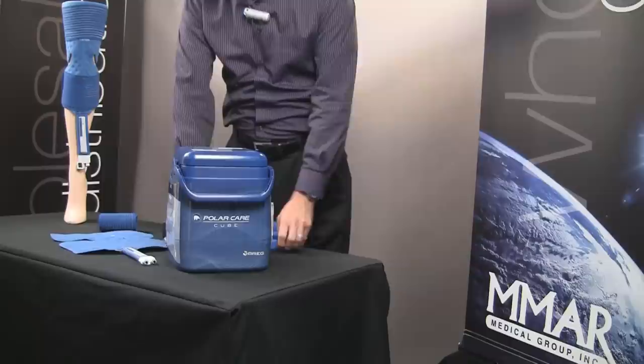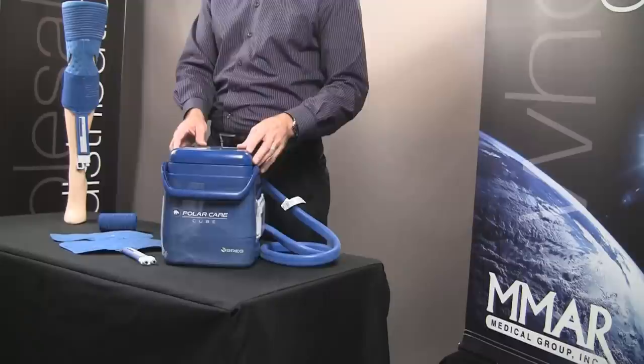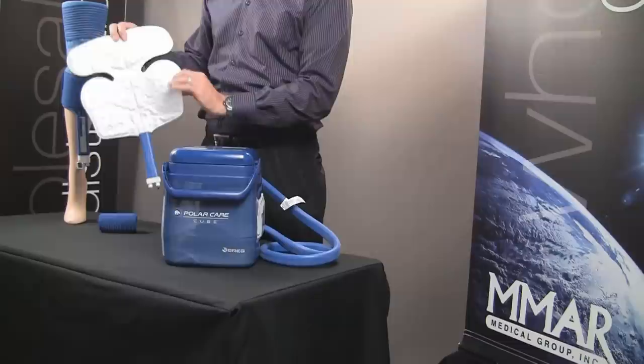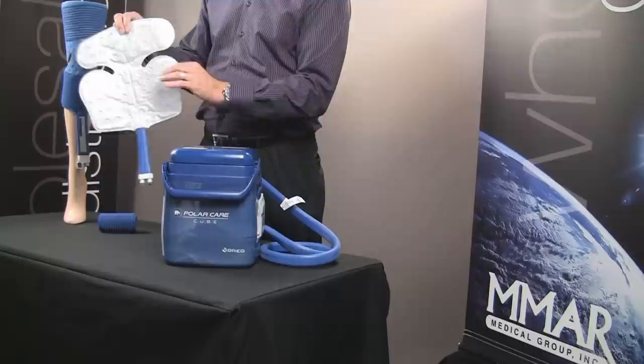When using cold therapy, let's talk about the safety features. With any type of cold therapy unit, one of the most important things is safety. Most critical is that the part of the pad where you experience the cold does not sit directly on the skin. There has to be some type of barrier — whether it's the bandaging from your surgery, a shirt, a sock, whatever it is — there just has to be some barrier between the pad and the skin. That's very, very important.